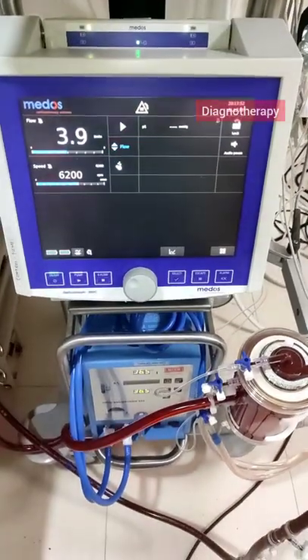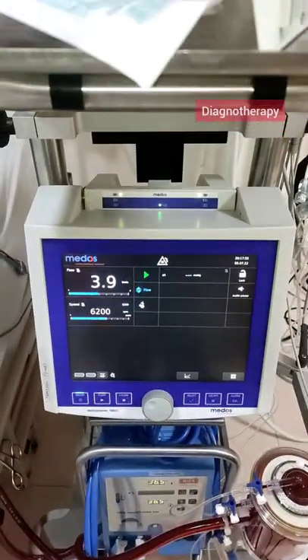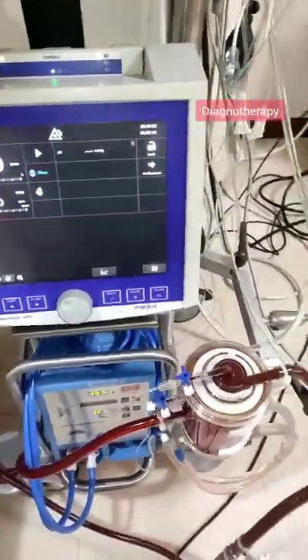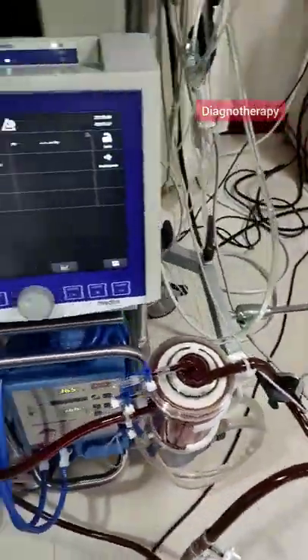In today's video we will be seeing the ECMO machine and the connections of the ECMO. This is an overview setup when it is attached to the patient.